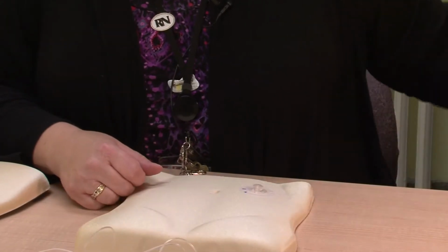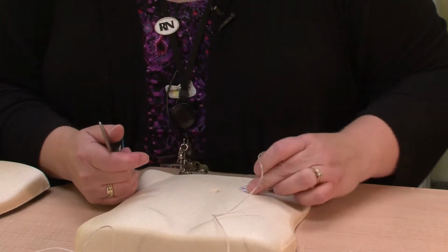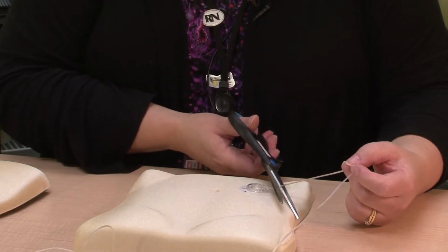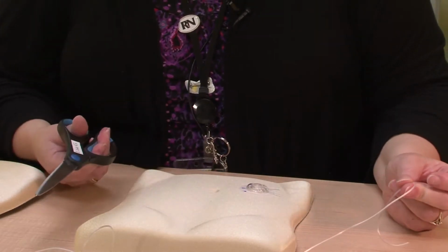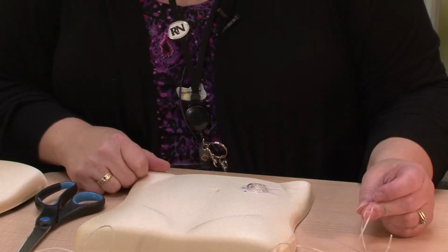If that doesn't work and you have a pair of scissors, you can cut close to the edge of the pump, snip the tubing, and now you no longer have the insulin infusing into the patient. When you're suspending the pump, you're just stopping the flow of insulin to a patient. When you're disconnecting it, then it's physically coming off of their body.